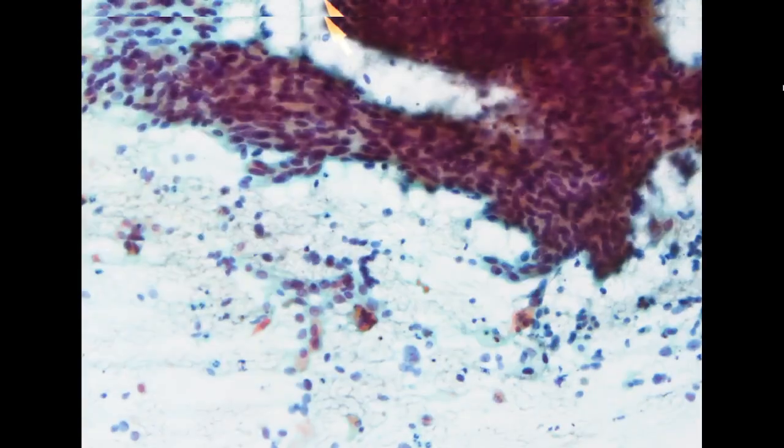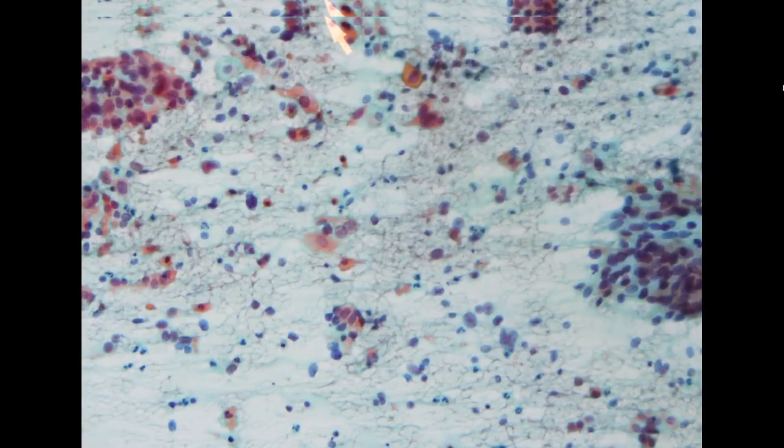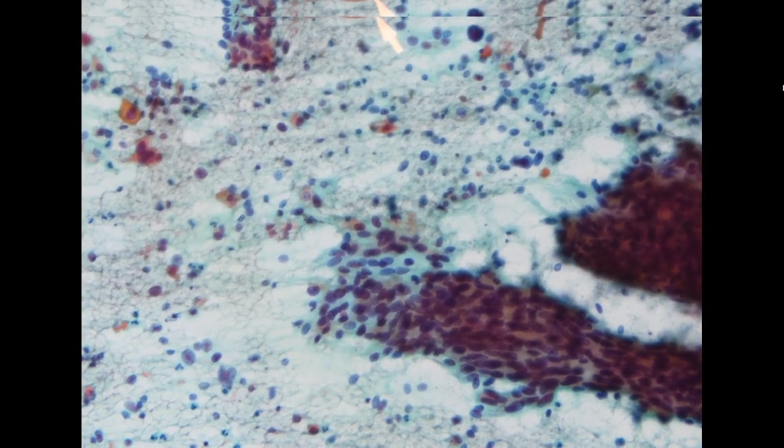Although it looks scary, like everything has a high NC ratio, when you go to higher power, the chromatin pattern is delicate and homogeneous, not coarse chromatin, and the pattern is throughout the entire smear. Then we should be reassured that this is an atrophic pattern. But if we start to see more keratinized cells with apparent nuclear atypia, I think we need to be a little bit worried.